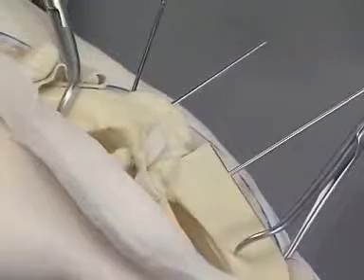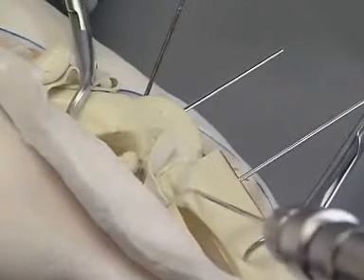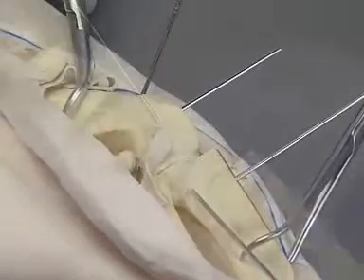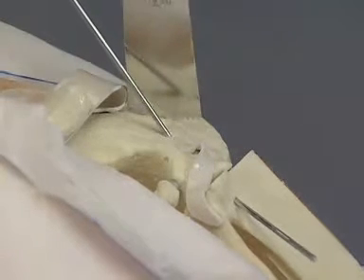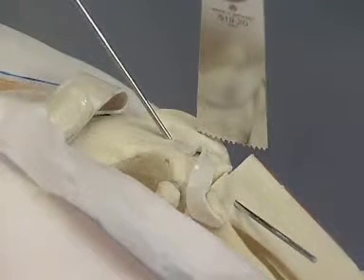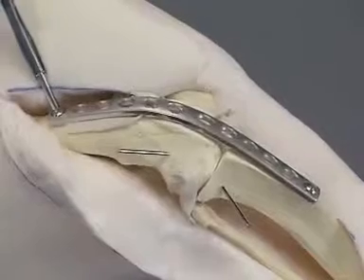The femoral and tibial ostectomy surfaces are opposed and fixed temporarily with K-wires. The guiding K-wires are removed. The trochlear ridges are resected to improve plate contact. An appropriately contoured 12-hole 3.5 DCP is applied.